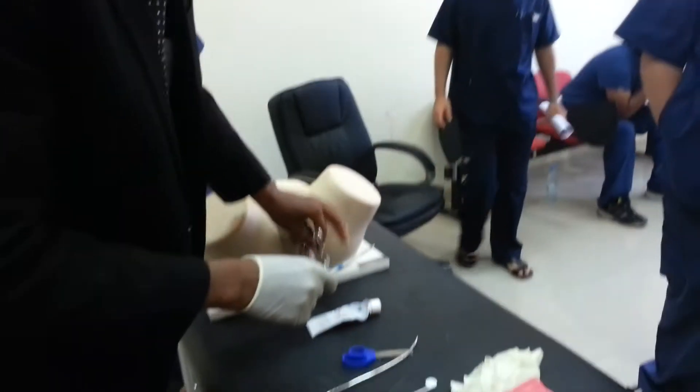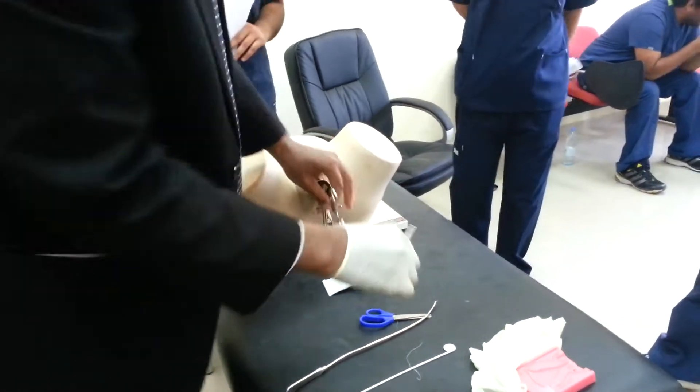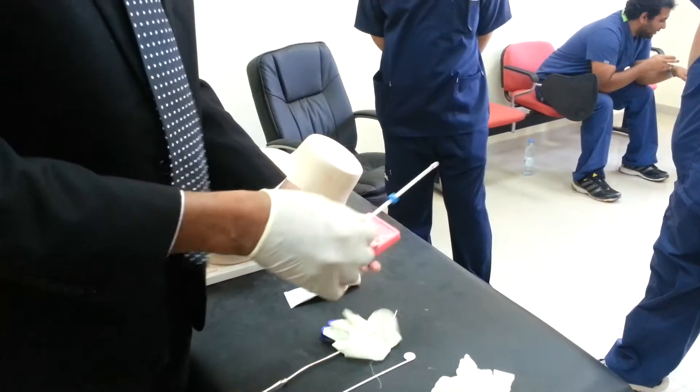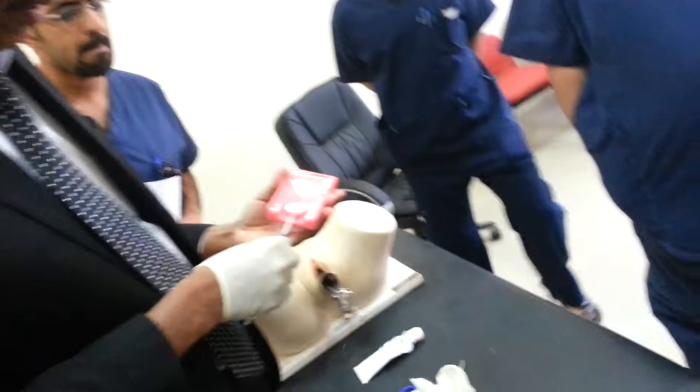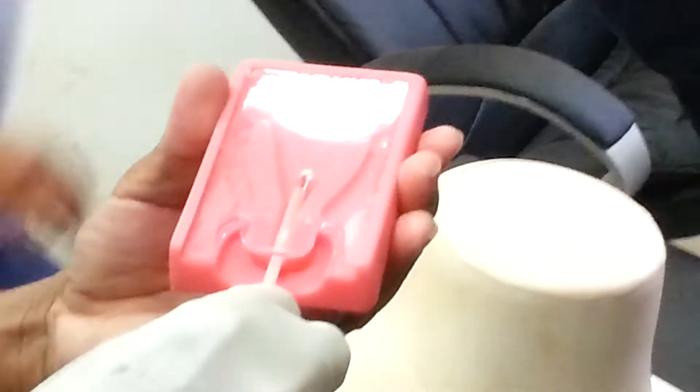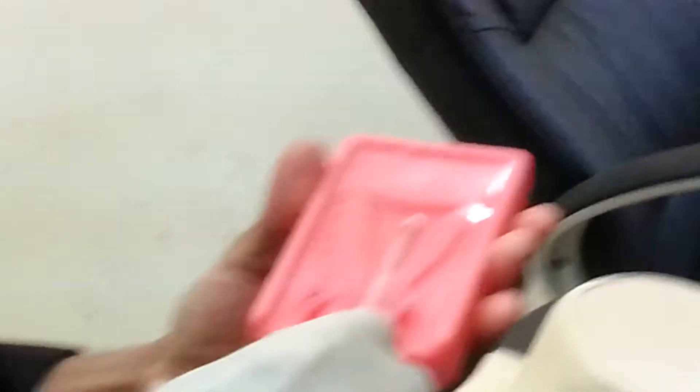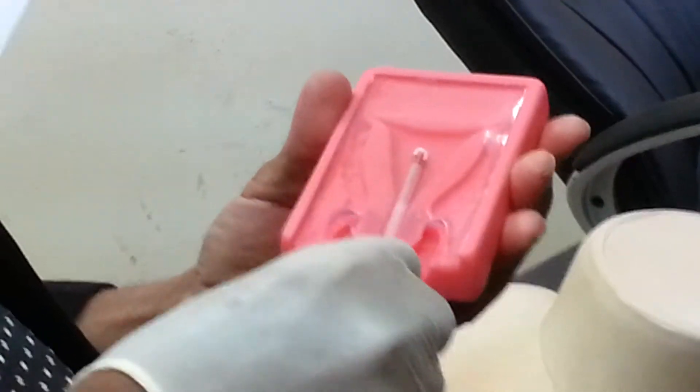Then you hold the speculum and you insert the side. To be more obvious for you, looking here, you introduce it to the side like this. And you use it up to that, usually the level of fundus.